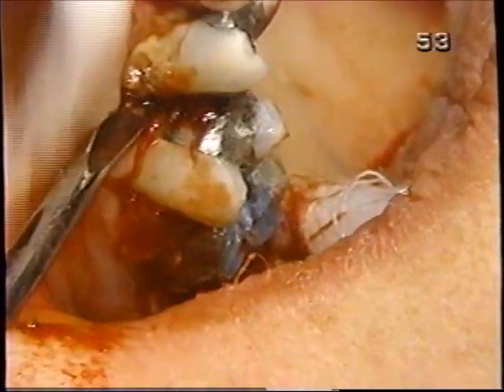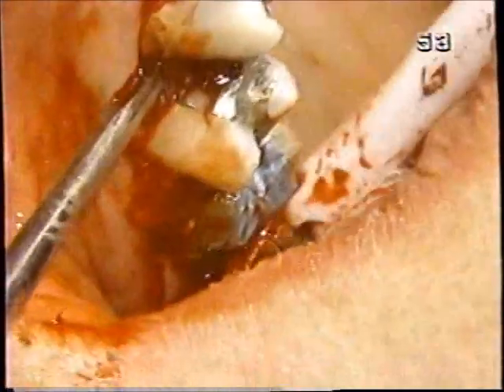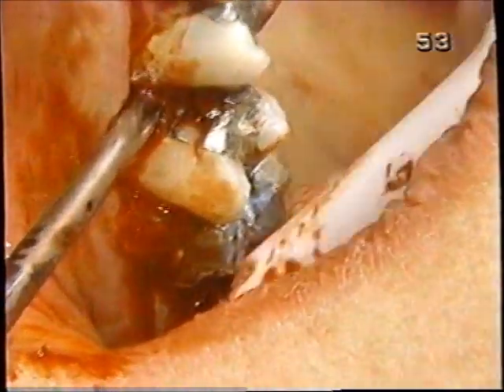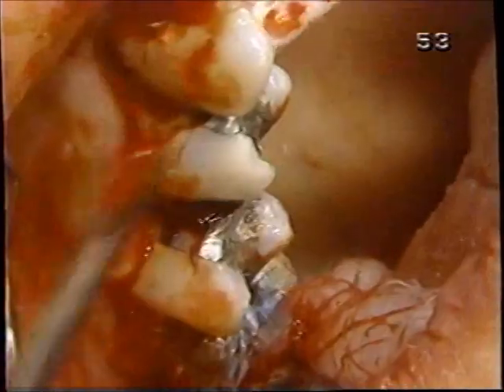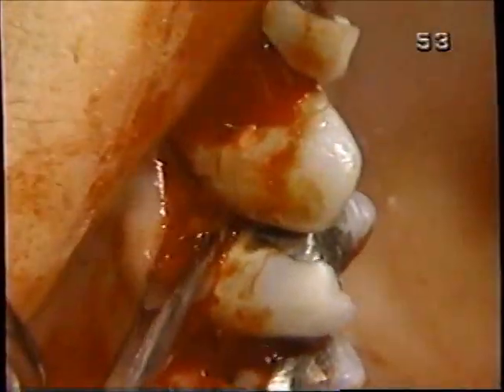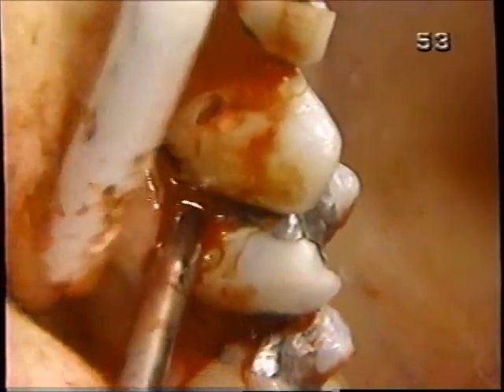Some people ask me, which way do you turn the 301? Do you turn it clockwise or counterclockwise? Well, generally it's counterclockwise against the tooth that you're removing, but as Peterson points out in his book, Contemporary Oral and Maxillofacial Surgery, you can do it either way.